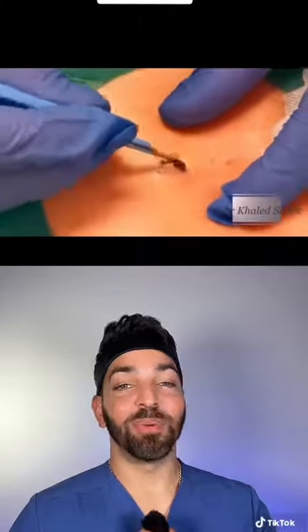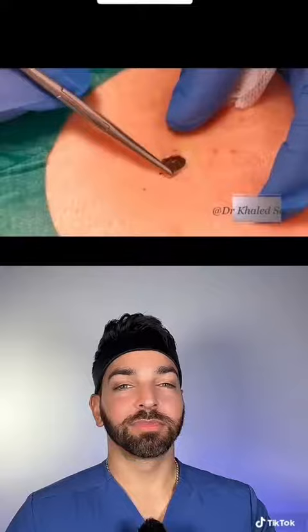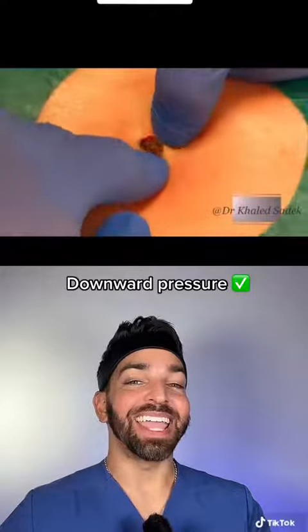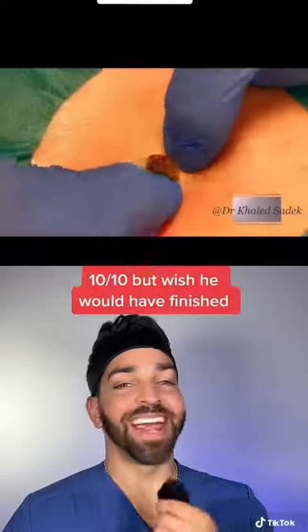He then uses a scalpel to open this up. At first it looked like a double-headed blackhead, but now this is all just one piece. He comes with downward-inward pressure to help push this out. Ten out of ten.